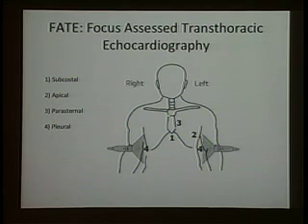and it should be your first one, because if you get a good subcostal view, you get most of the information that you need. The only problem that I will tell you that this has is that in an awake patient it can be uncomfortable, because you're basically digging in, you're pushing in, so some patients may not like it. Some patients may have a big abdomen or a big distended belly that makes it tricky. But a good subcostal is actually very good, and you should be able to get this very easily.